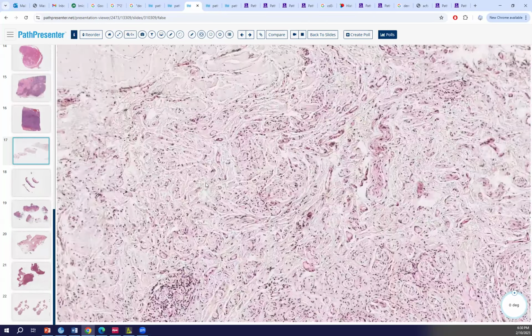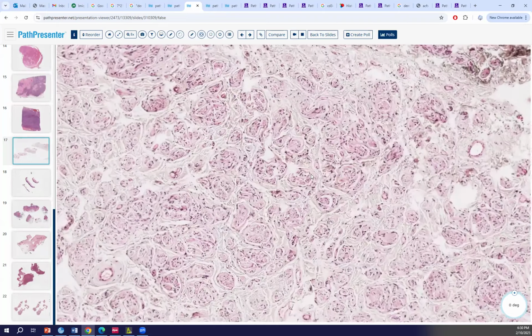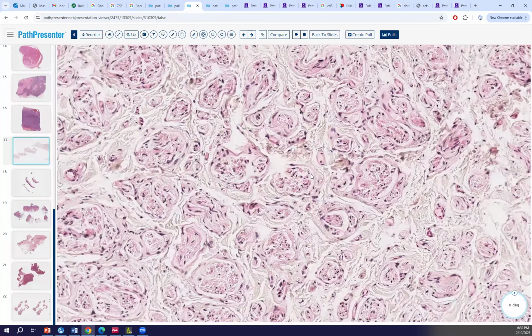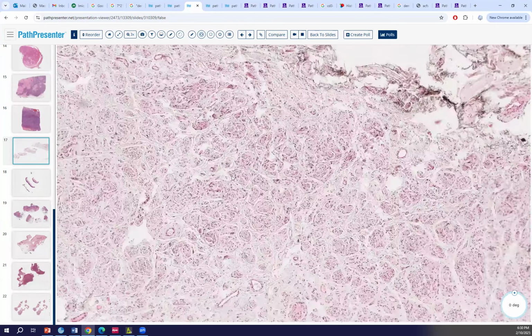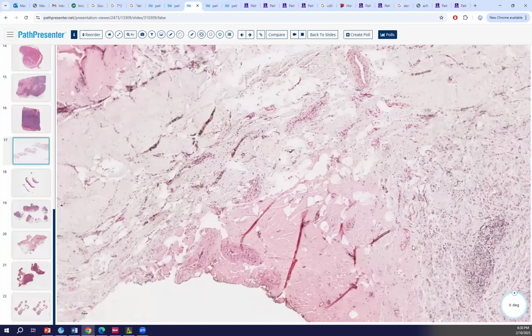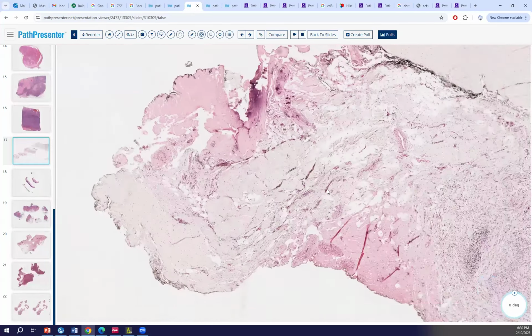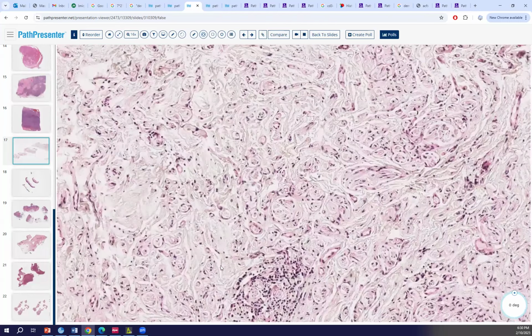Anyway. Avi, do you think they will give us scar tissue as a reference point? Otherwise, how are we supposed to know this is a traumatic neuroma? Scar tissue looks very different from a neuroma, be it a Morton's neuroma or a traumatic one. But oftentimes the traumatic neuromas are embedded in fibrosis in the scar. Morton's neuromas tend to have perineural fibrosis. It's kind of interesting. Two things are going on here.